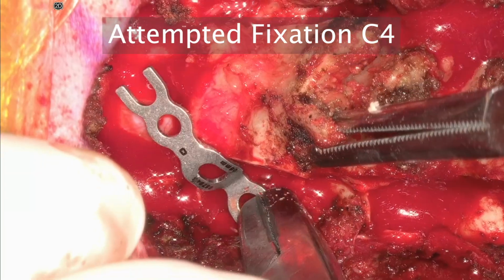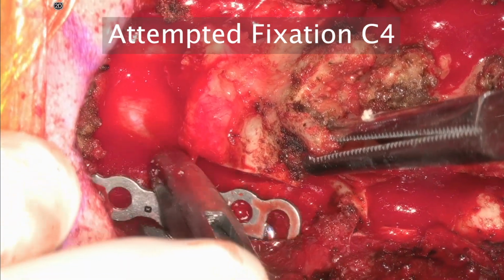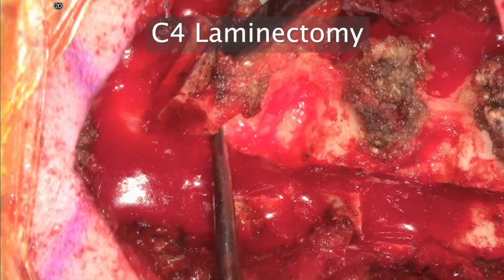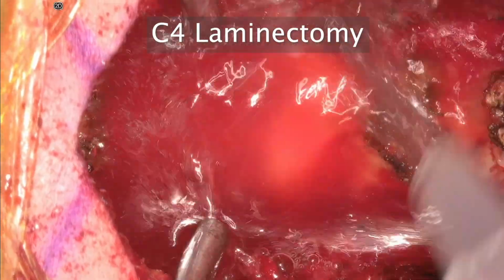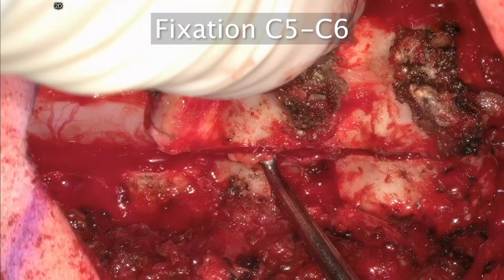In this case, we realized that a laminoplasty at that level was not going to be stable. We also know that even with removing C3 and C4, with this fixation at C5, C6, this laminoplasty would still be stable, and the patient would therefore also have reduction of her symptoms. Really, it becomes quite apparent. The best thing to do is to complete the C4 laminectomy.